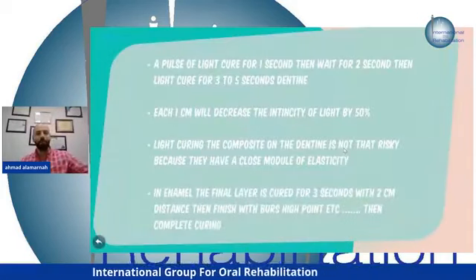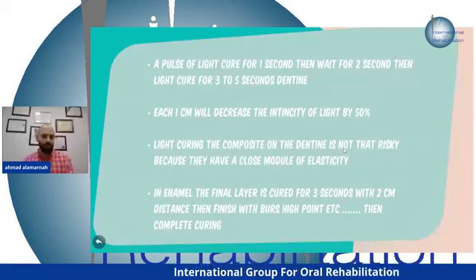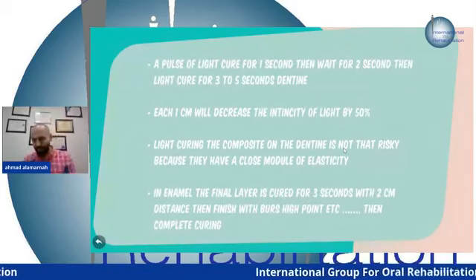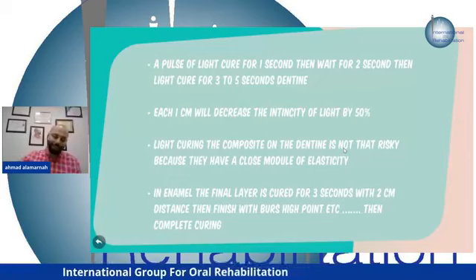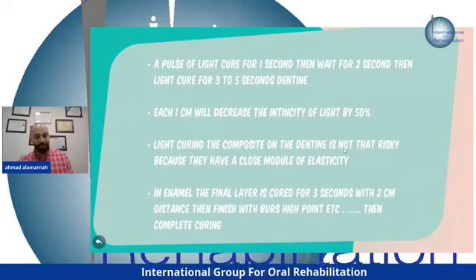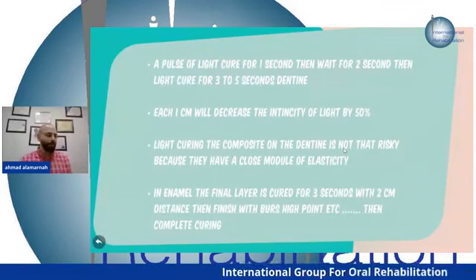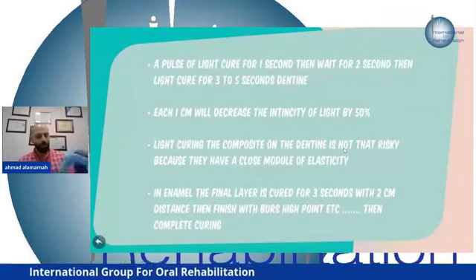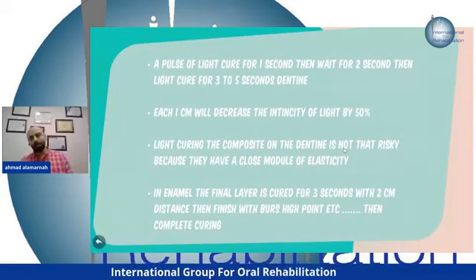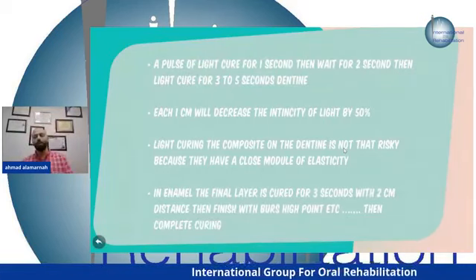This is what we have been talking about. I do it for like 1 second, then I wait for 2 or 3 seconds, and then light cure for 3 to 5 seconds. For the enamel, I do not cure like this. Sometimes I use this, but I remove the tip like 1-2 centimeters away from the enamel and do 3 seconds. 3 centimeters. If I have like 1,200 milliwatt per square centimeter power for the light cure, if I go back 1 centimeter, this is 50%, so it's 600. Another centimeter, it's another 50%, so it will be 300.